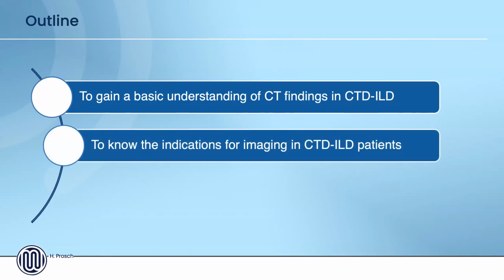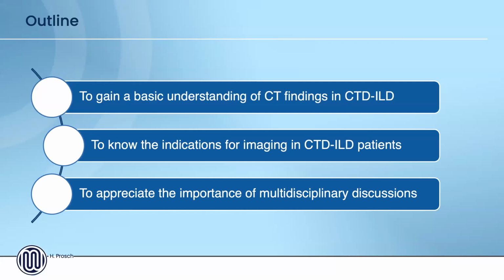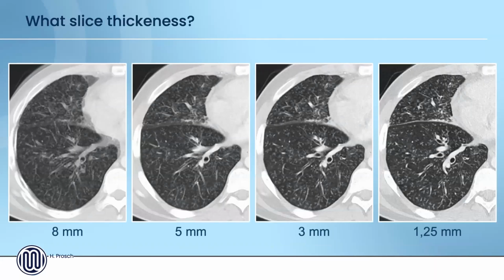In this talk, you will also understand the indications for imaging for CTD ILD patients. And last but not least, you should appreciate the importance of multidisciplinary discussions, as in many cases the diagnoses are not as straightforward as you might get the impression in this presentation, because it will show you simple cases. But I can assure you, on a daily basis the challenges are quite there, and it's not always as easy as it might look like. Before we move into cases, let's just refresh your knowledge on CT.